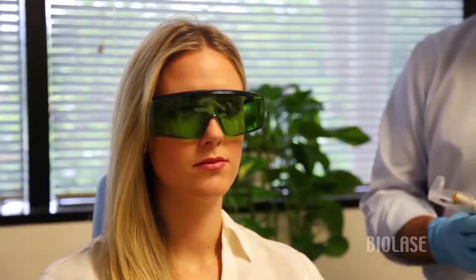What we have today is a light therapy handpiece — a laser handpiece — and this is from the only laser that's been approved in North America for pain therapy and for wound healing.